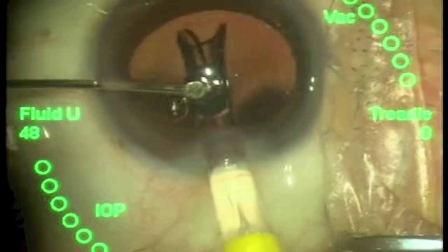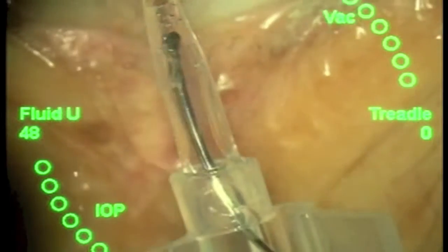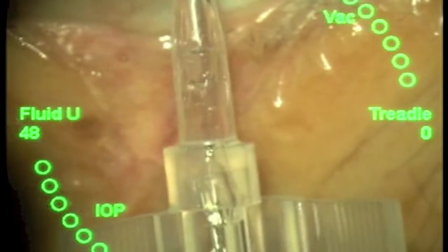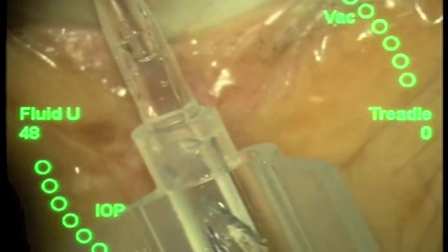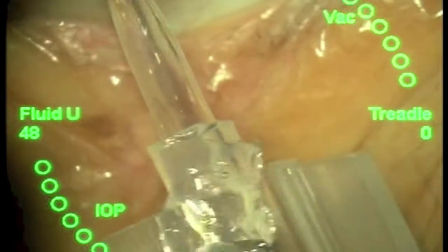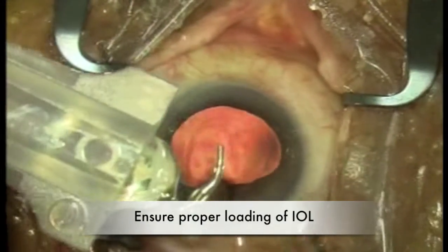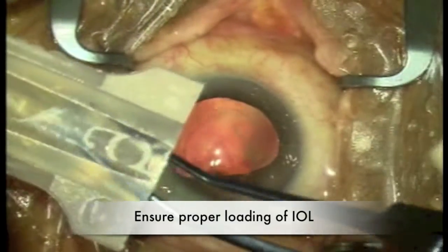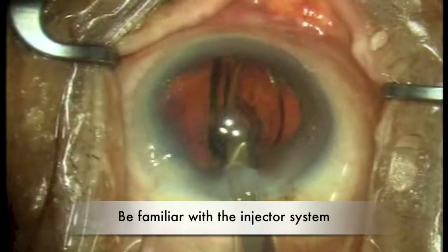In the next example, the lens had not been appropriately loaded into the cartridge and subsequently was stuck. And after careful inspection and removal, it was noted that the haptic had fractured and completely broken off. It is therefore important to take proper care in loading of the intraocular lens. Be familiar with the lens platform which is being used and always do it yourself.